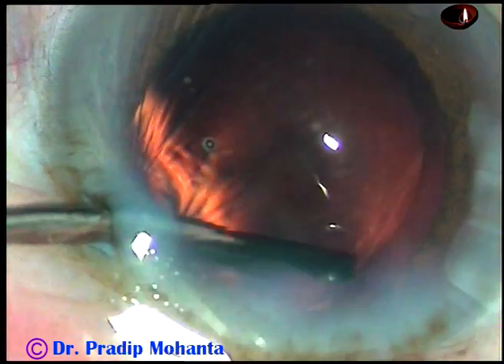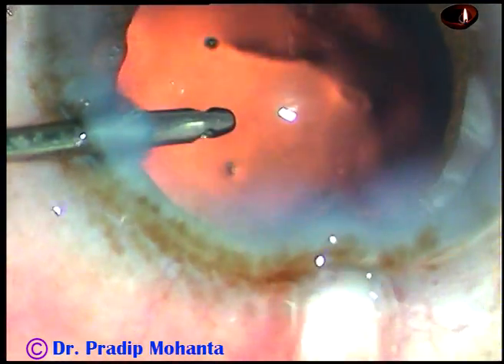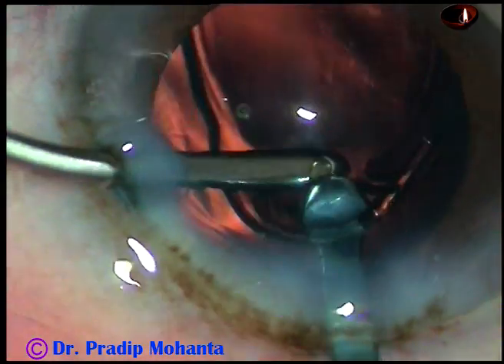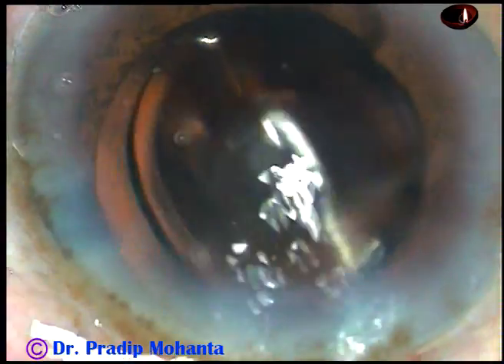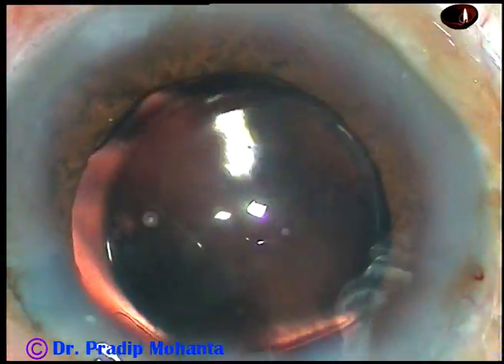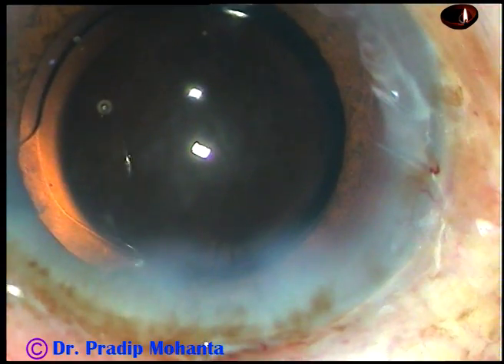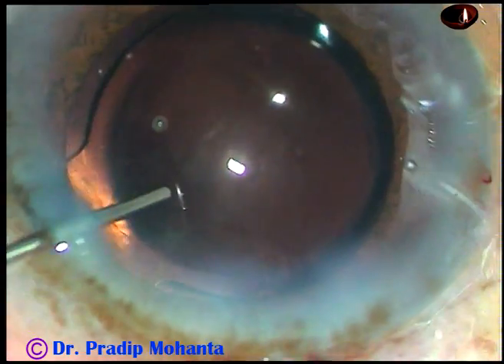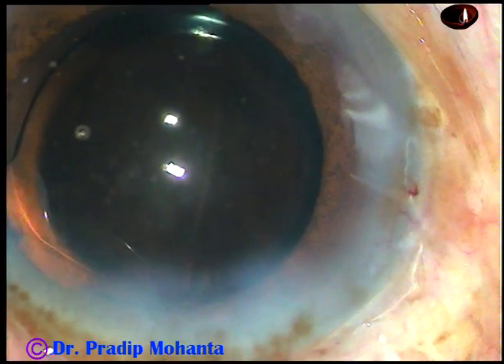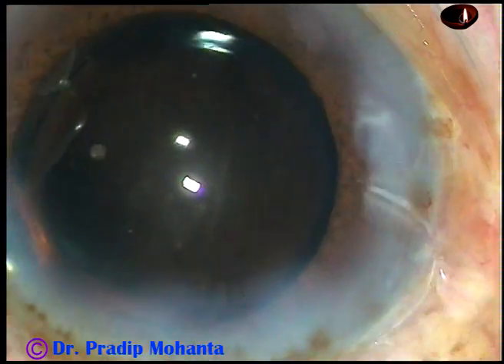In this case, a hydrophilic single-piece monofocal aspheric intraocular lens has been selected. And this is NASPRO from Appasami Associates. It's a beautiful lens, and Appasami has improved the quality of this lens recently. It's a good lens. I have no financial interest, but I'm very grateful to Appasami Associates and I appreciate the helping attitude of this company.